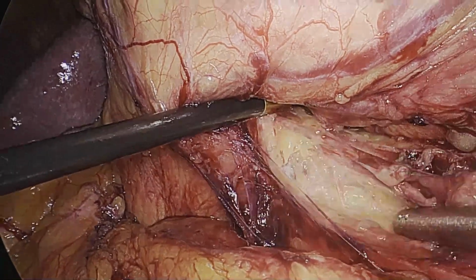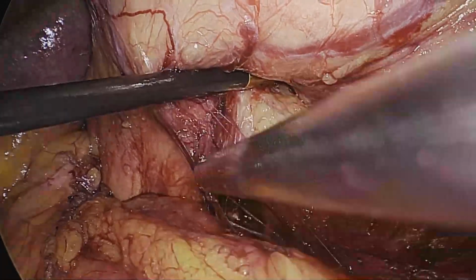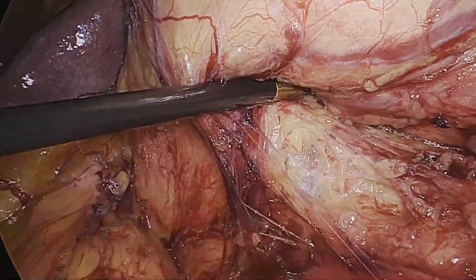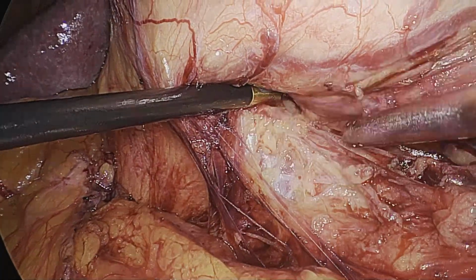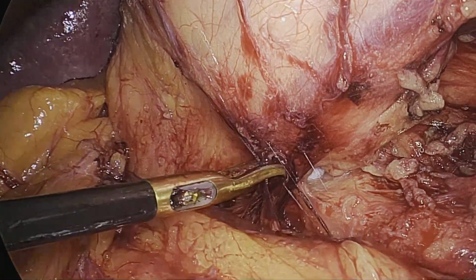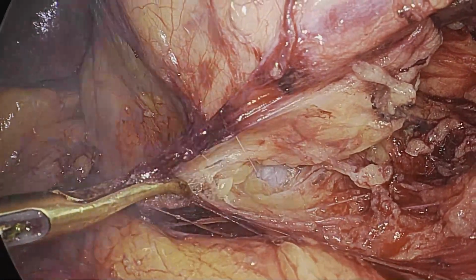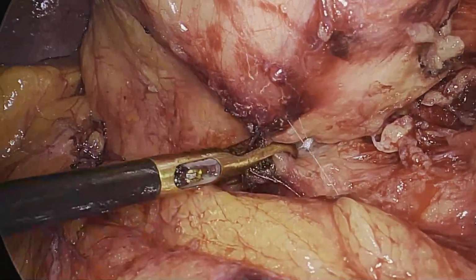Now here we are doing the dissection bluntly with the help of a suction. Suction is a great instrument to dissect the hilum, and it sucks out all the fat between the fibrous tissue and the lymphatics, so that the structures can become visible.